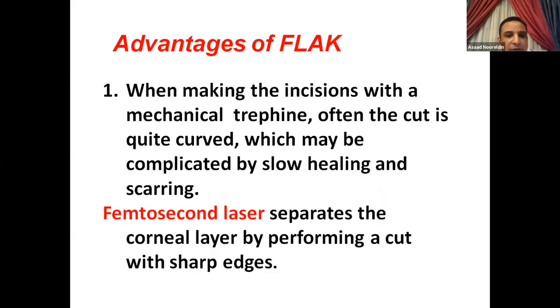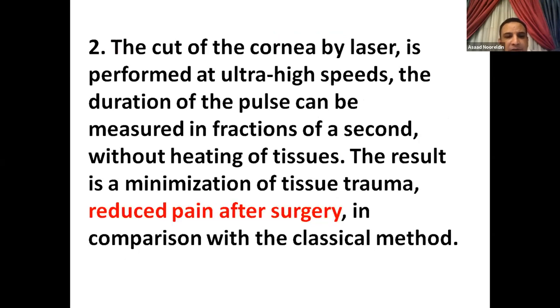What are the advantages of femtosecond laser assisted keratoplasty? When making the incision with mechanical trephination, the cut is quite curved, which may lead to complicated, slow healing and scarring of the wound. But with the femtosecond laser, with separation of the corneal layers, we perform a cut with a sharp edge. The cut of the cornea by laser is performed at ultra high speeds. The duration of the pulse is measured in fractions of seconds, without heating of the tissue. This leads to minimization of tissue trauma and reduced pain after surgery.